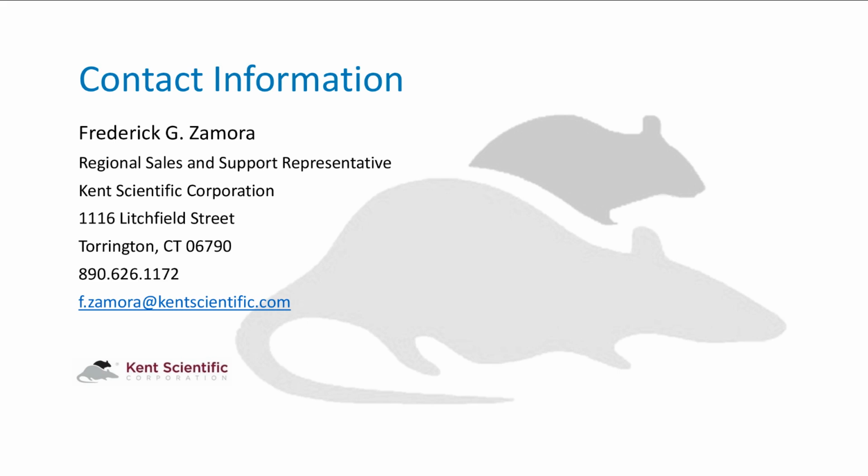Hi, Sophie, by the way. I personally have not seen any differences. I do believe that I have heard people talk about slight differences in variability in using different animal strains. I cannot speak to that at this moment, but I can go ahead and follow up with my colleagues to see if they have noticed anything.